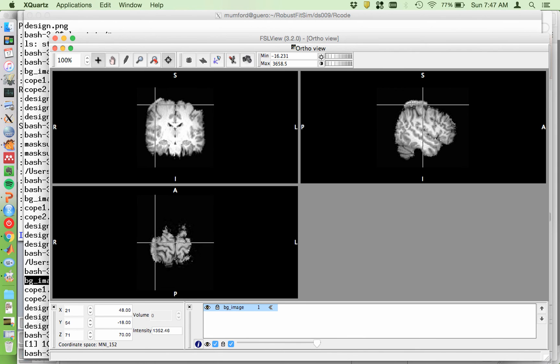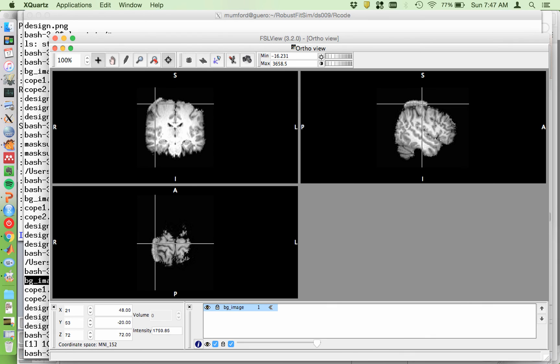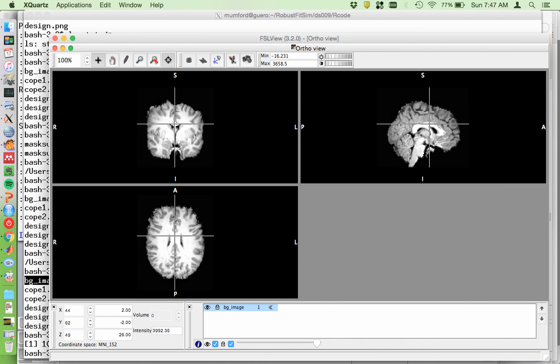There's a little wacky bit here — that's okay, it's just the skull that got blurred up. I'm not really that worried about it; I believe I used nonlinear registration. So that's all this is — this is just this subject's structural in MNI space. In the third level analyses, we'll see that this is the average over all the subjects' structurals in MNI space. For displaying statistics, I always like to use this image instead of the actual MNI template.